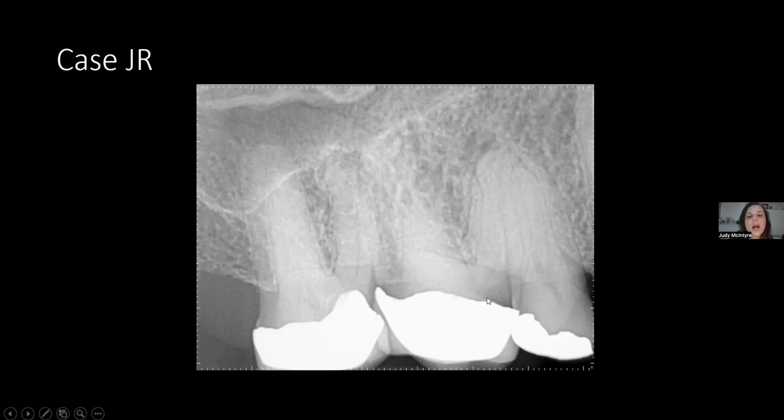So I would say whenever you're trying to treatment plan a larger restoration or a crown, have a PA taken within the 3 months of that restoration being replaced to be sure that there's no periapical lucencies, and also test that tooth. You don't want to marry them to something costly, no matter the cost, that's going to become shortly symptomatic right after. So back to this patient.